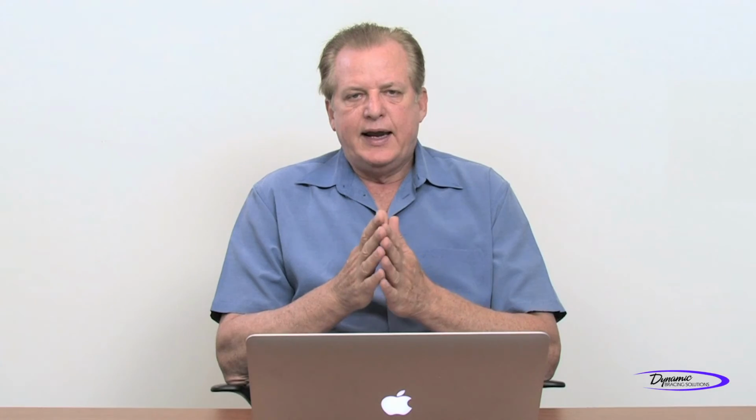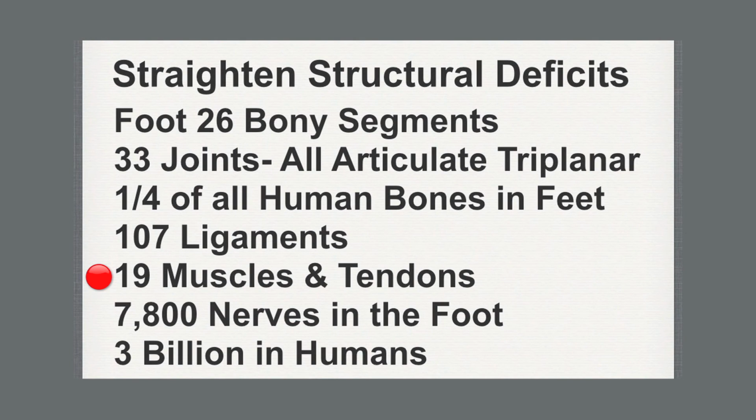And so each person, each human, has their weak links that we have to protect. You have to think that a simple device that doesn't protect these is, in the long run, actually poor management in lower extremity orthotics. We have 19 muscles and tendons that we also have to consider in this whole process.